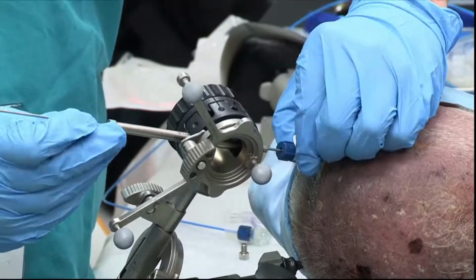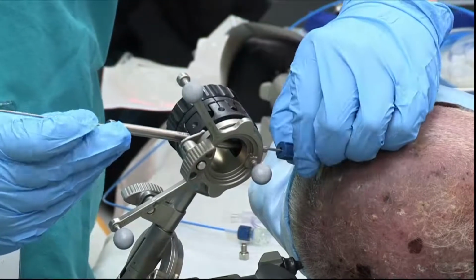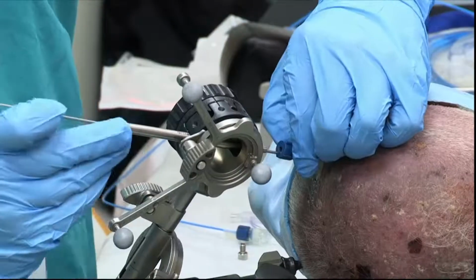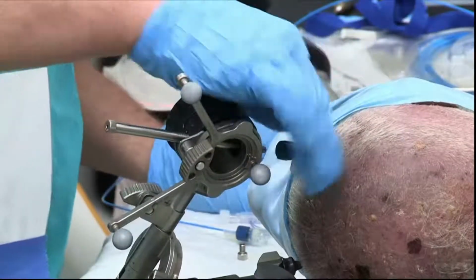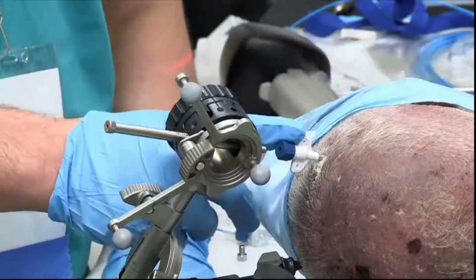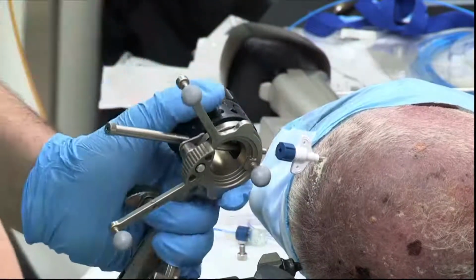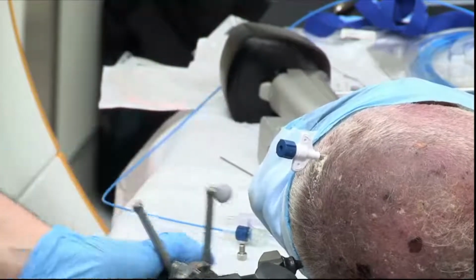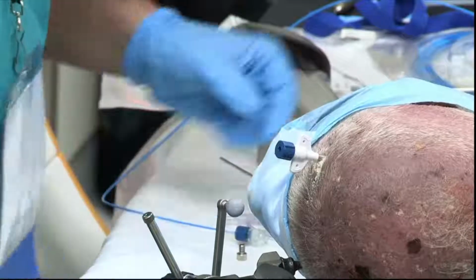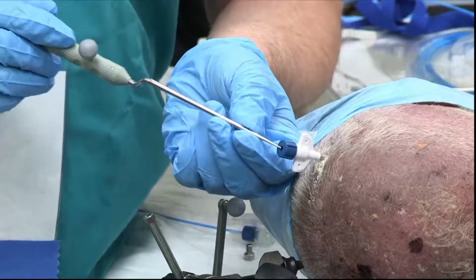Okay, so we're definitely in. You can feel now if you've actually been through the dura, but you certainly don't want to go down to target. So now that we're fixed, our trajectory is completely fixed, and we're locked into whatever this is going to tell us to go, right? So we can take this out of the way. Even take it off. And then we're going to check our basically depth to target.